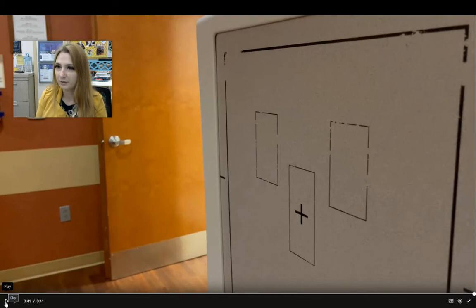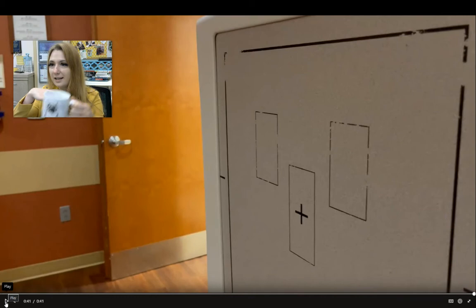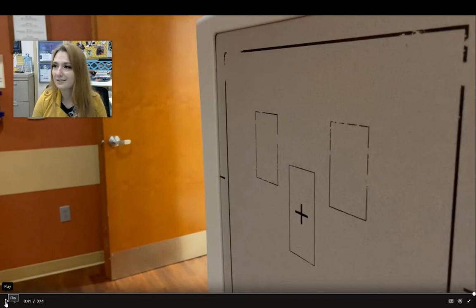And do you need a grid for a hand? Well, think about that. Here's the thickness of your hand, and here's the thickness of my coffee mug. Absolutely not, you don't use a grid for a hand. So that's why we can actually remove it from the wall stand.